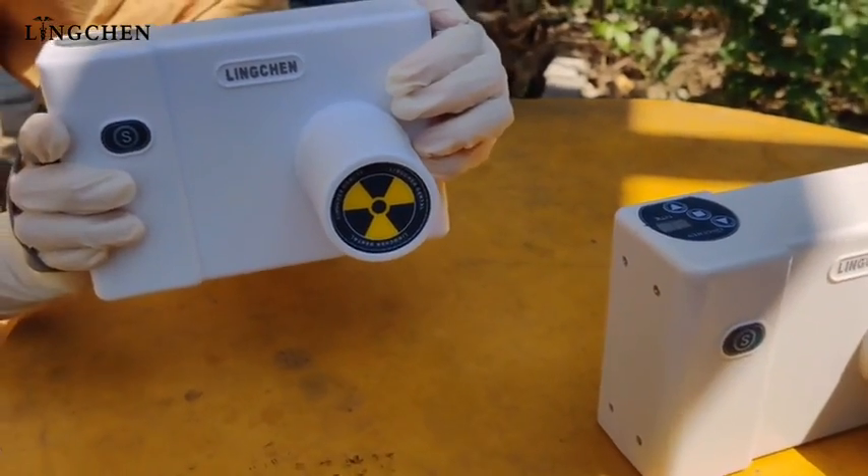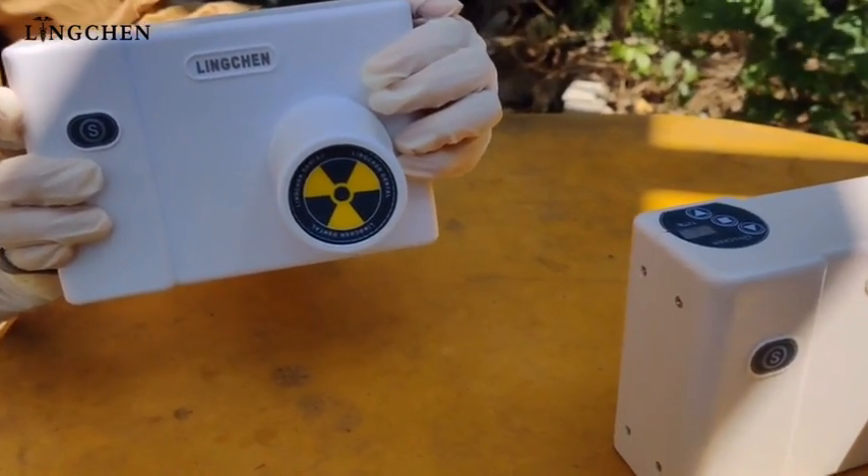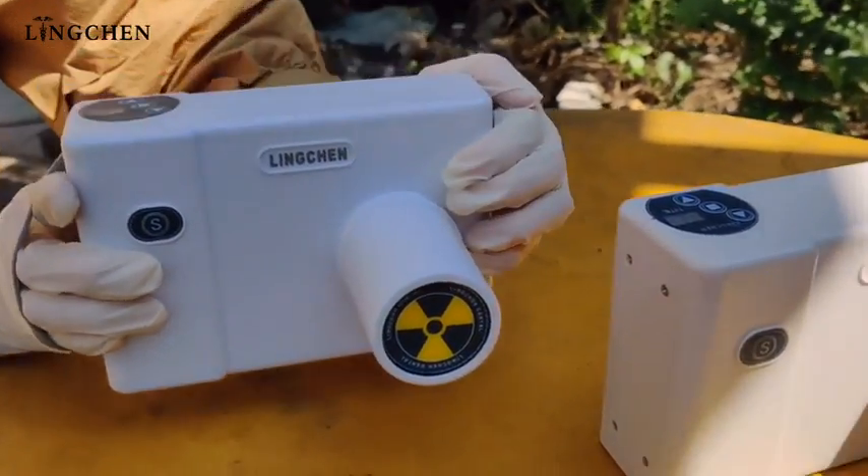It is one of the most hot-selling products now at Lingchen. We hope to support more dealers to introduce it in your market. Thank you.